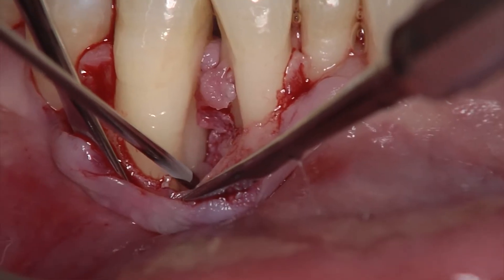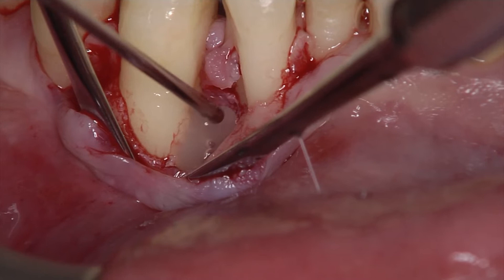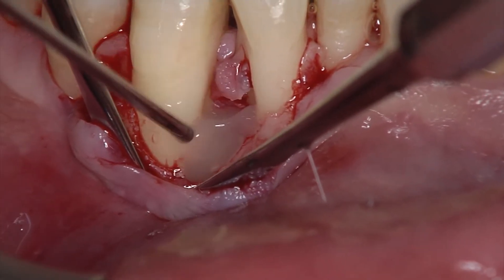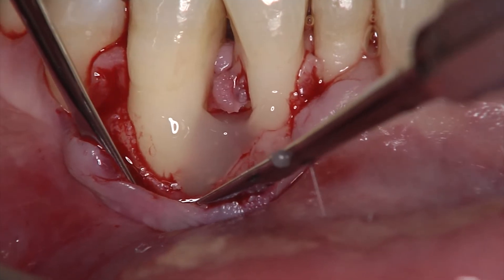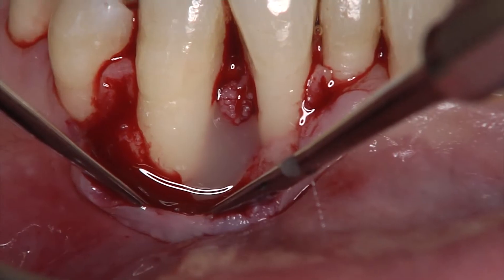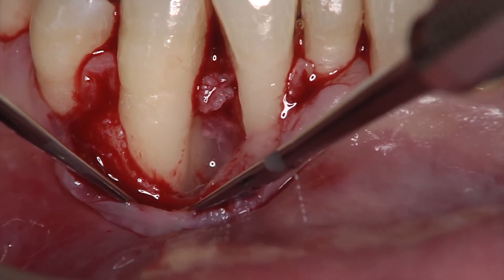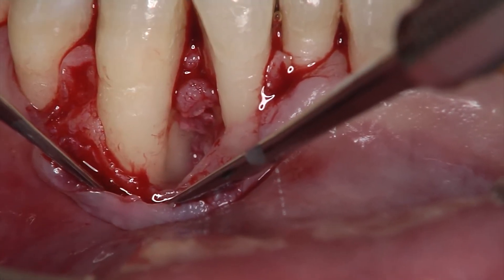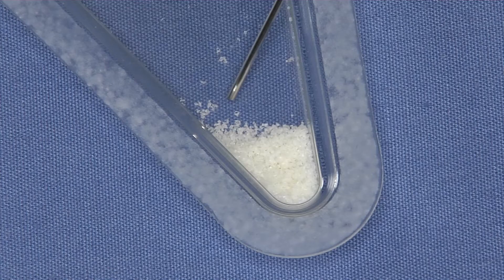A first layer of Straumann Emdogain is applied on the exposed, clean, and blood-free root surface by starting at the most apical bone level. A blood-free and clean root surface is important for the precipitation of amelogenins on the root surface. Therefore, controlling the bleeding and reaching an appropriate level of hemostasis is necessary.